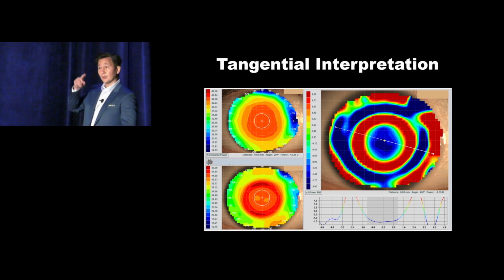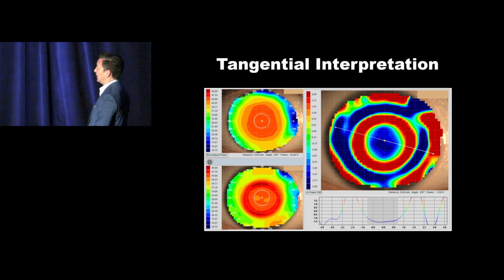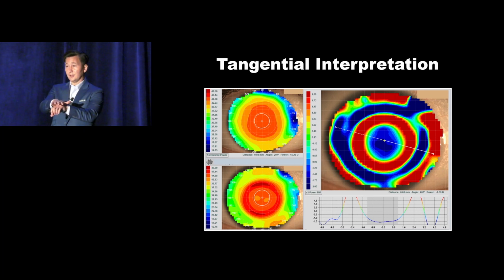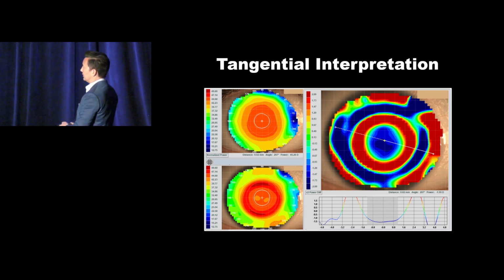So you know that your ring, your reservoir is concentric, so we should see a concentric ring running all the way around. What's the next zone in the lens? You've got ortho-k lens that's close to the cornea in the center. Then you've got that reservoir of fluid, right? What's the next zone you see in the fluorescein pattern? The alignment zone, right? And the alignment zone creates this blue flattening that you see here.